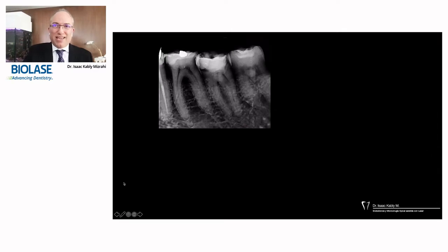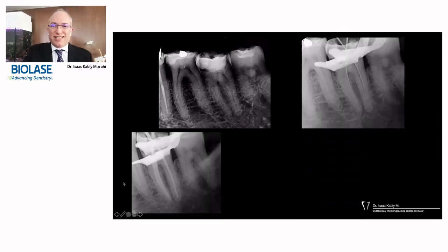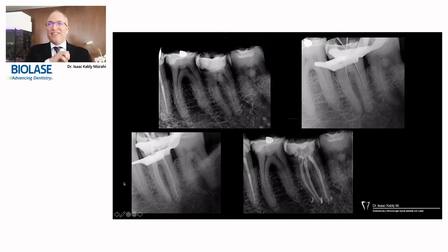So when we speak about laser-assisted endodontics, most people refer, as I said, to Christmas tree outcomes like this one, when you have the access and lateral canals filled with cement and some complex anatomy looking great in the x-rays. Don't get me wrong, I love to see this every single day, but my focus is on the healing of the periapical tissues, not on how the x-ray looks. I want the bone regeneration to have an amazing post-operative treatment for my patients, and most of the time, without needing any antibiotics or any painkillers.